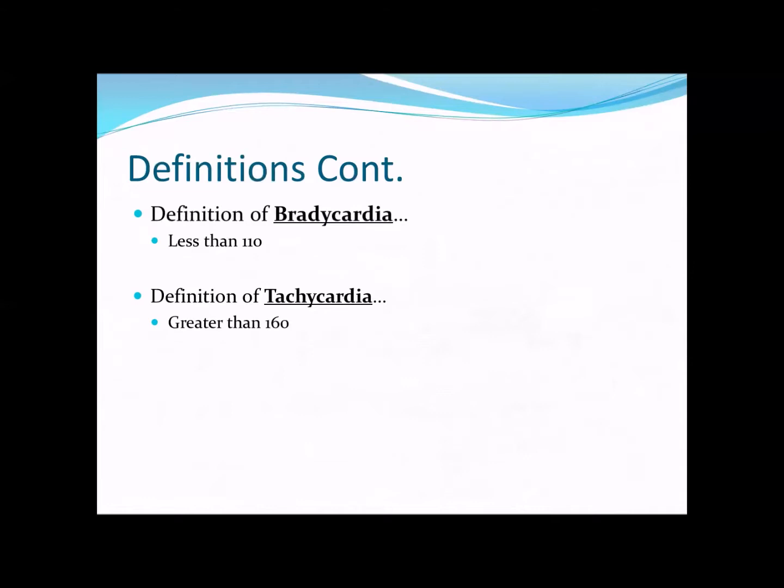I'm going to pick on you a little bit because you've done your OB rotation. What might cause a baby to be a little bit tachycardic? Cocaine dependence? Yeah, drug use is definitely good, and that can go either way. If mom just used, then we can really see a high fetal heart rate.